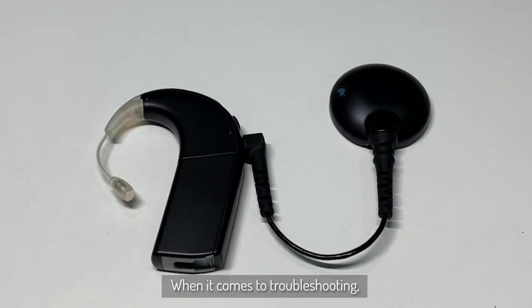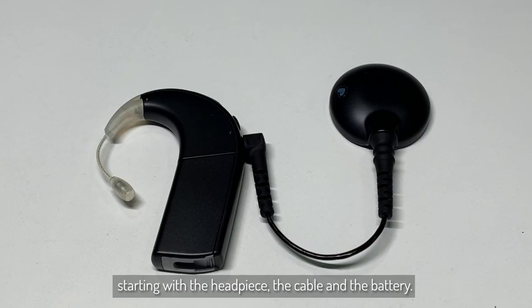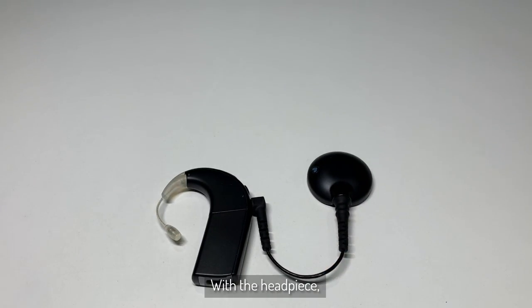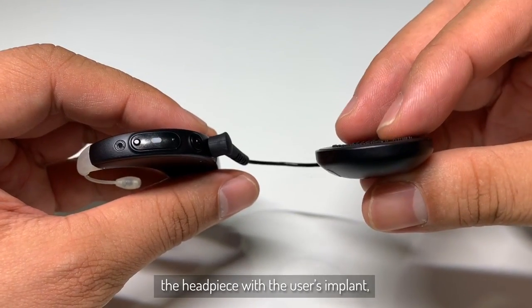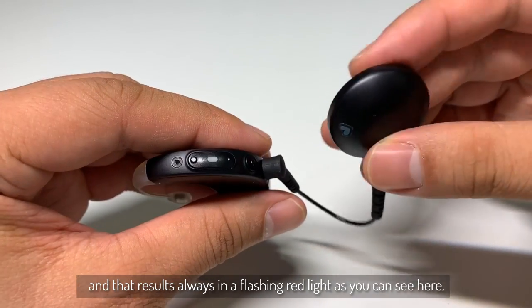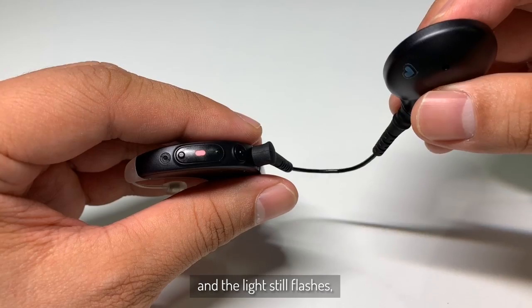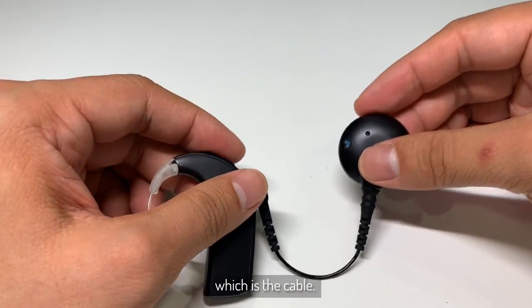When it comes to troubleshooting, it's best to look at the components one by one, starting with the headpiece, the cable, and the battery. With the headpiece, people often make the mistake of not connecting the headpiece to the user's implant, and that always results in a flashing red light as you can see here. Now if you have connected the headpiece to the implant and the light still flashes, that's when we look at the next component of the troubleshooting, which is the cable.